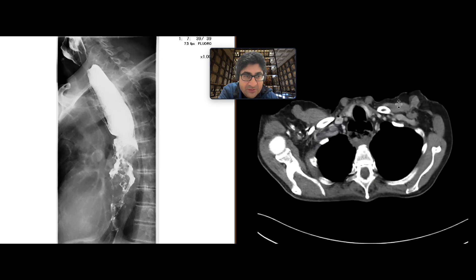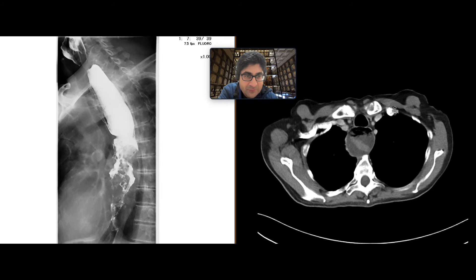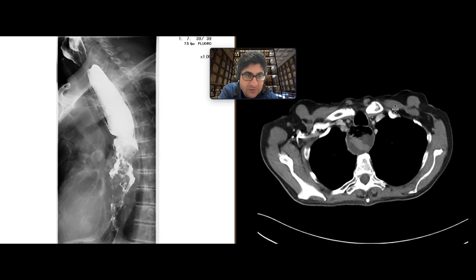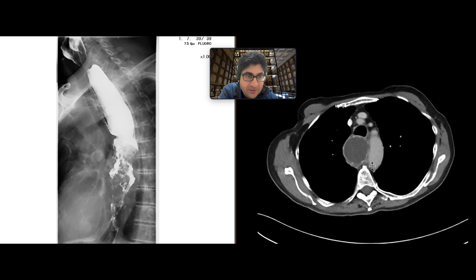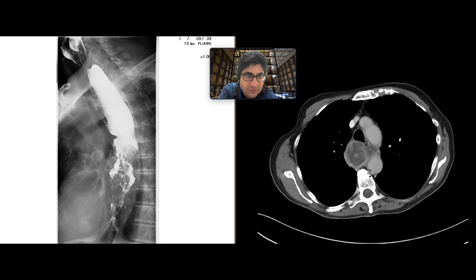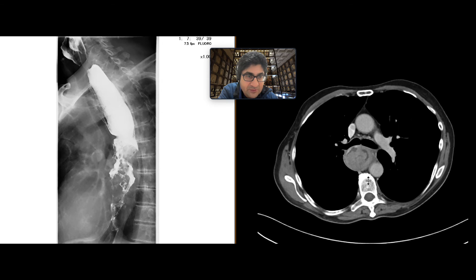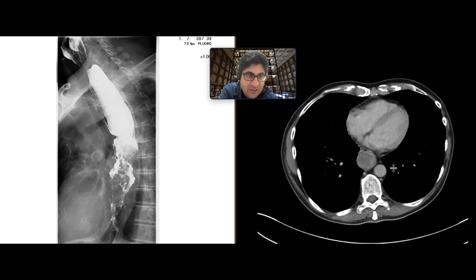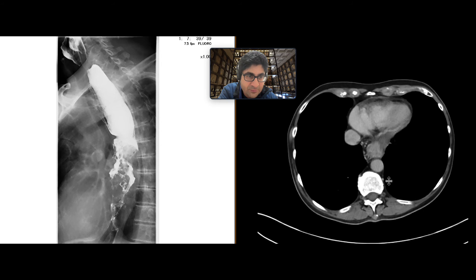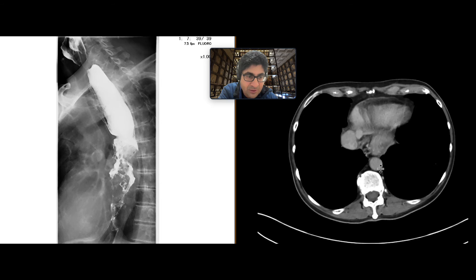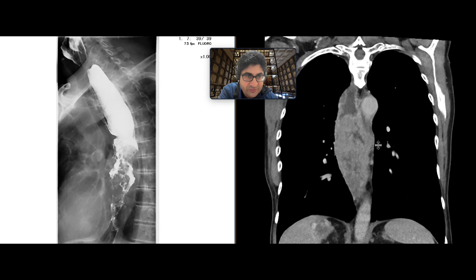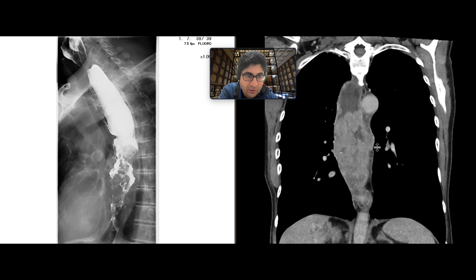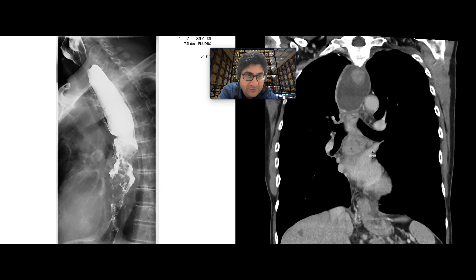This patient then got a CT scan to evaluate this and to look for staging. We can see intraluminal content trapped in the esophagus and a soft tissue mass starting in the mid-esophagus, expanding it, going all the way to the bottom. That small hiatal hernia is visible at the bottom as well. These findings are seen nicely on the coronal images — quite a long segment neoplasm with soft tissue thickening and irregularity.